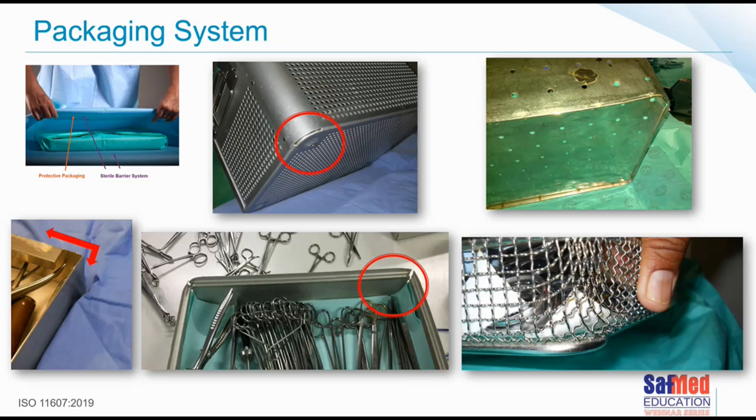Under difficult circumstances like that, it's very difficult to expect the sterile barrier system to stand up to these rigorous circumstances. We can't expect paper material, and we certainly can't expect lower grammages of SMS to withstand these kinds of circumstances. It does make it difficult, and that is when we tend to start making use of things like standard cotton linen as a third external layer to try get some form of protection. But it is based on our circumstances.